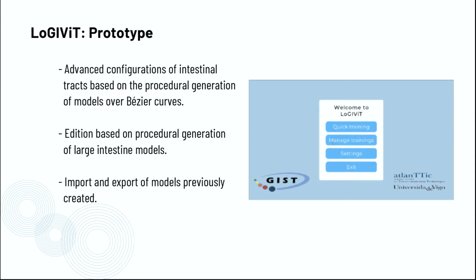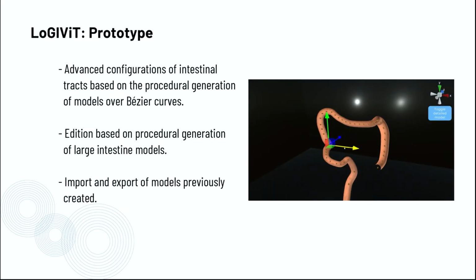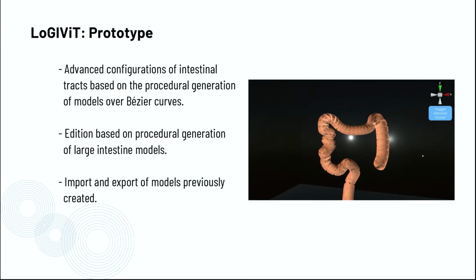A built-in editor for creation and editing of large intestine models was developed based on the procedural generation solution. This editor provides the means for an easy configuration of intestinal models that can be exchanged between users along with a training configuration.